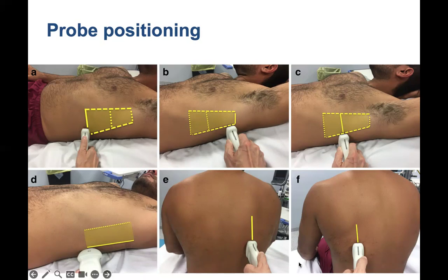In E and F here, if the patient's sitting up, you can see that you can do it posterior as well. Again, making sure that you are at a location where you can see the diaphragm in order to orient yourself.